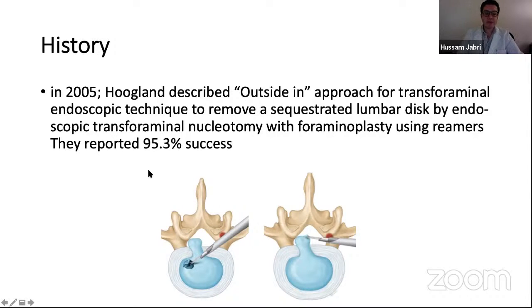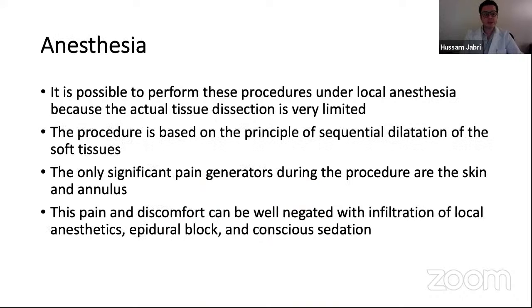He reported 95% success. Nowadays, not all foramina need to be enlarged because of the improved optics and smaller diameters of spine endoscopes.